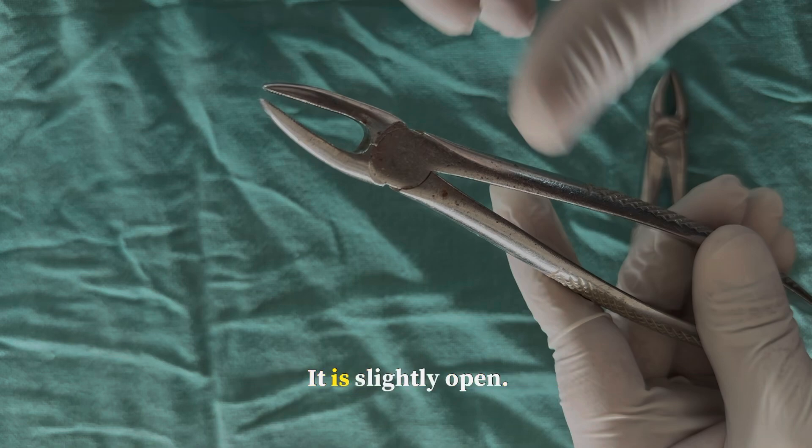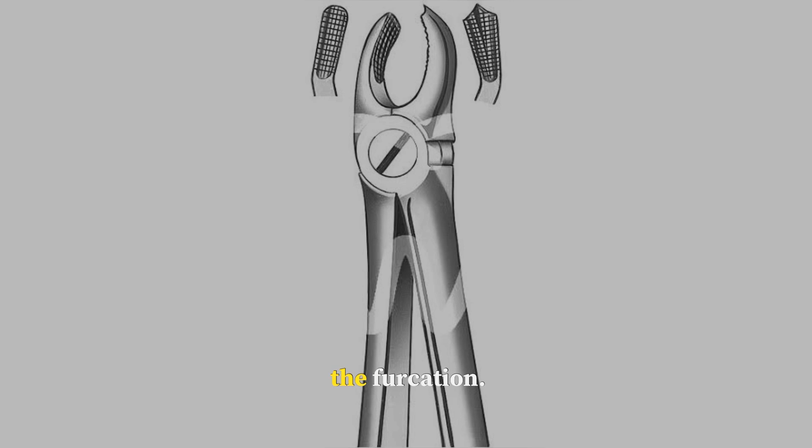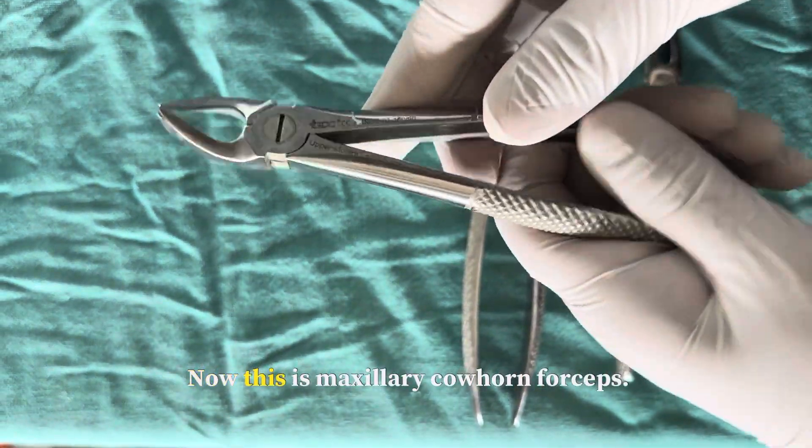For molars, just remember that the pointed beak will always be on the buccal side to engage the furcation. So by that logic, comment whether it is left or right.